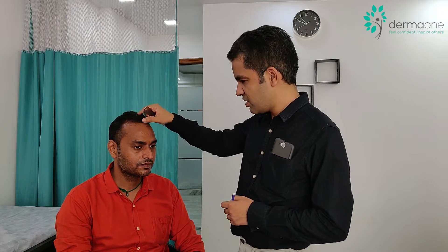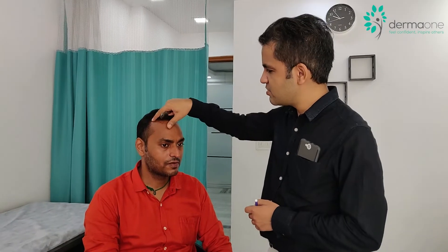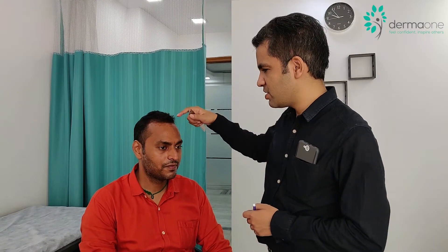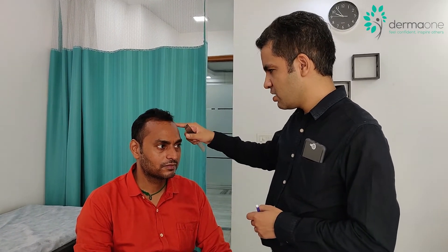Wherever you are thinning, we will transplant it. And where it is bald, we will also transplant it. So we should cover this whole area today.